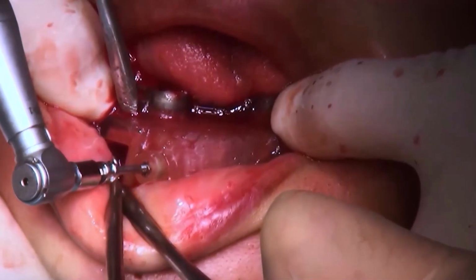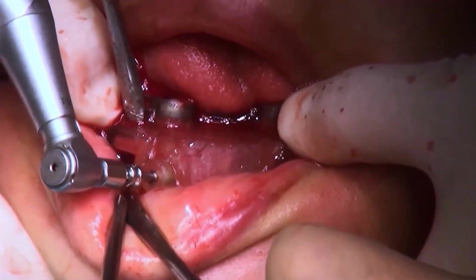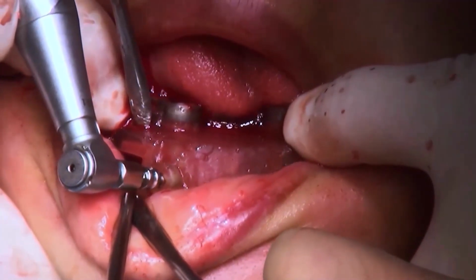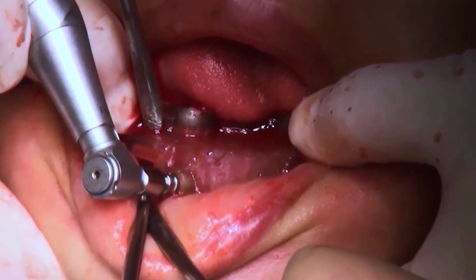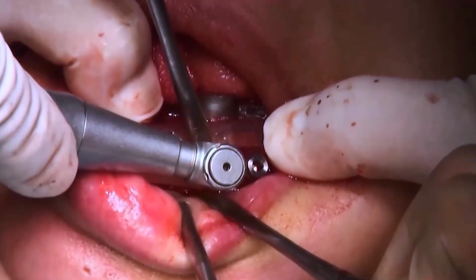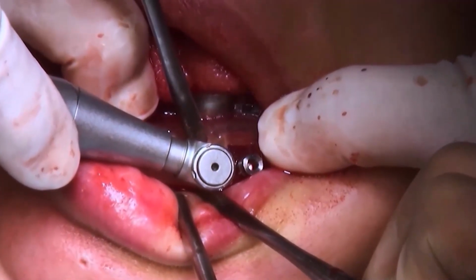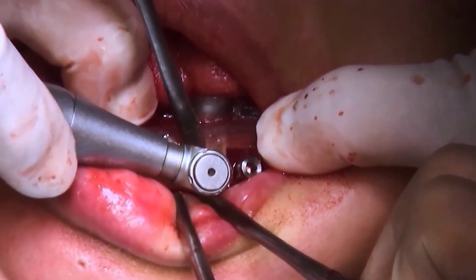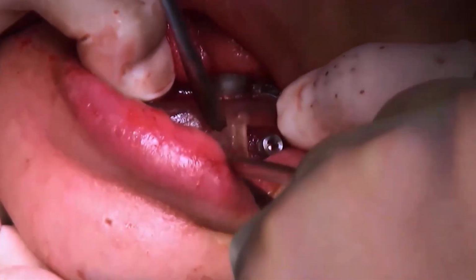This anchor screw is to fix the surgical guide part. Another anchor screw to fix the surgical guide part.